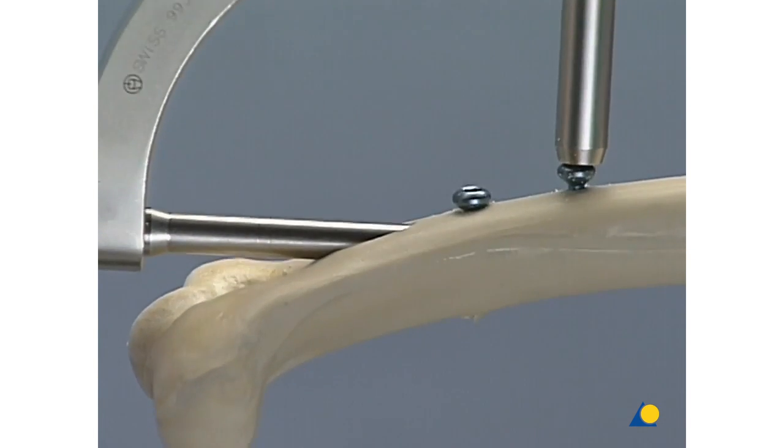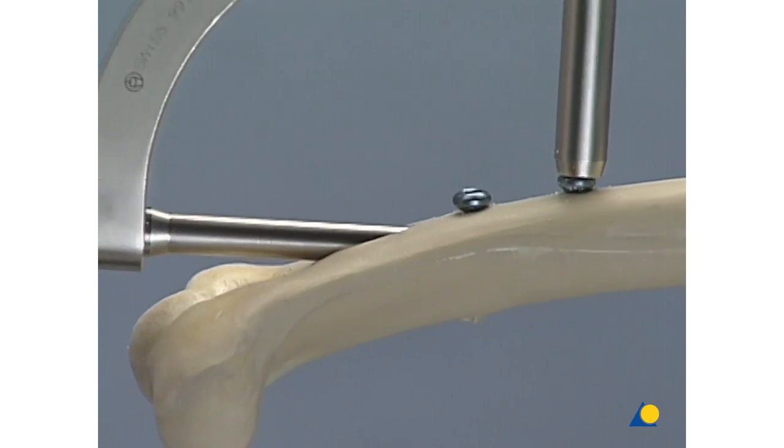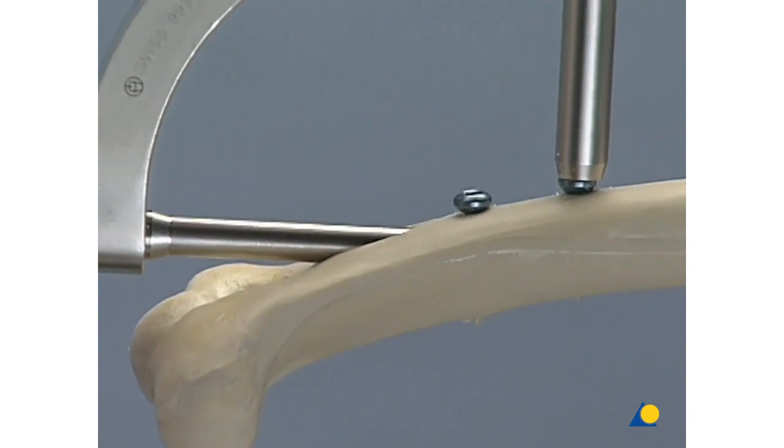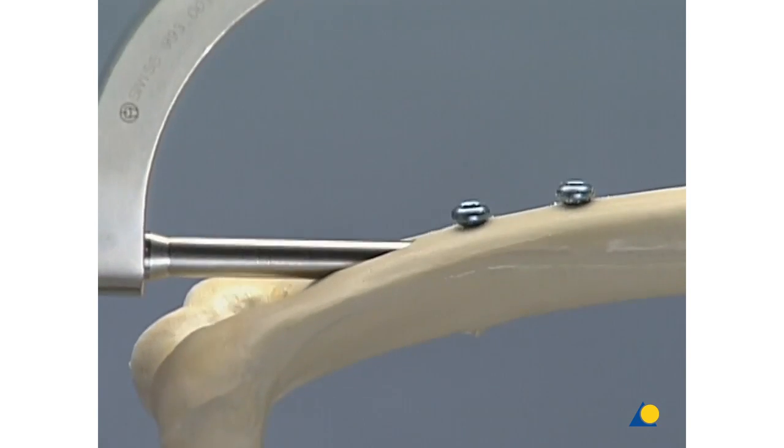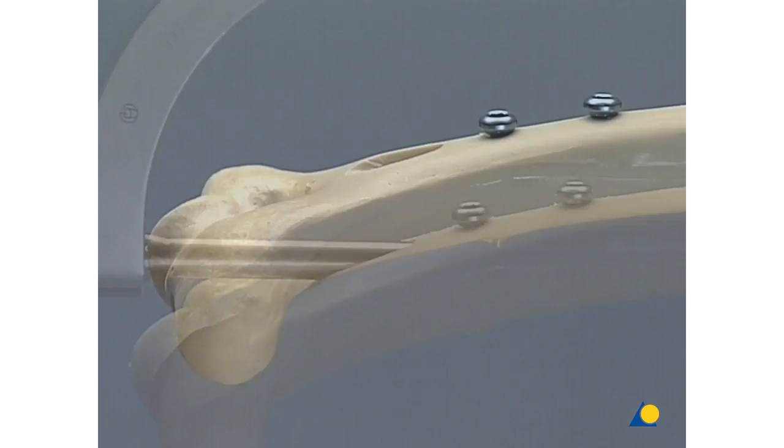To hold the reduction, a second locking bolt has to be inserted through the static hole. The compression device is now removed and an end cap inserted into the end of the nail.